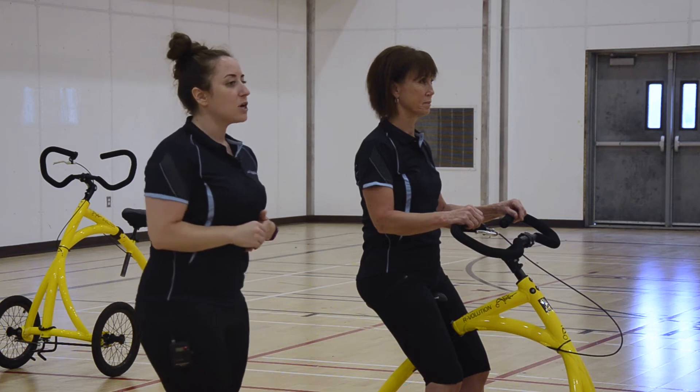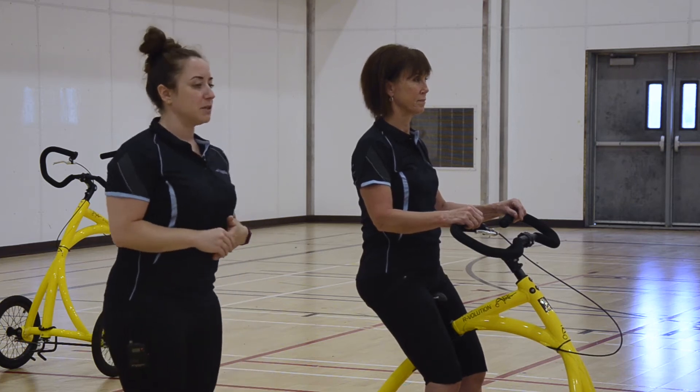This is an instructional video for how to do a pec stretch. You're going to start by sitting nice and tall on your bike, with your feet firmly planted on the ground.